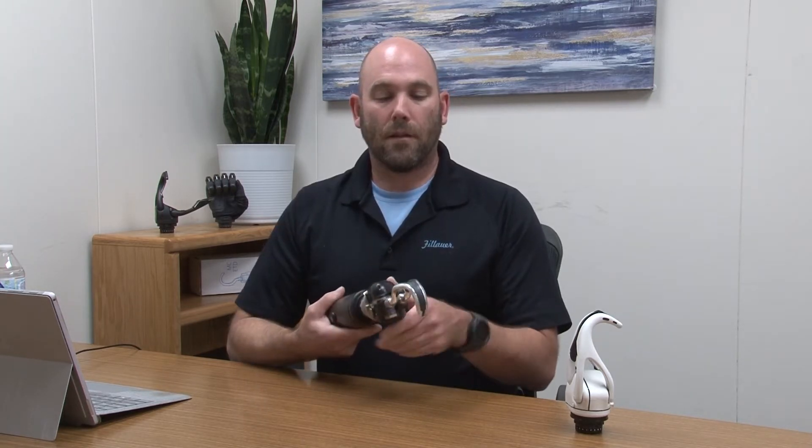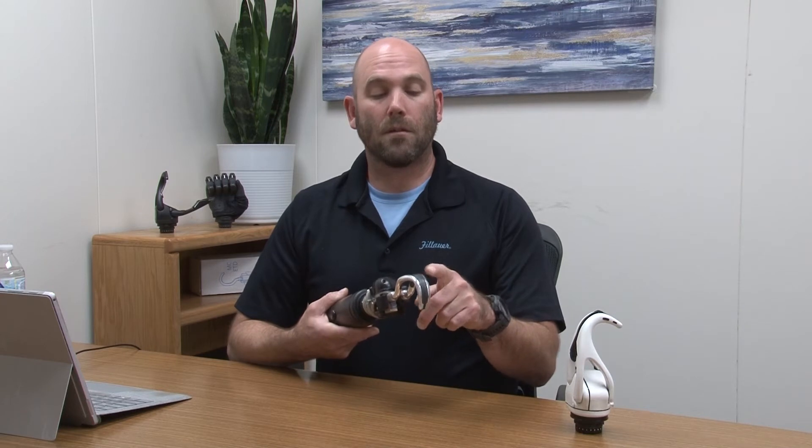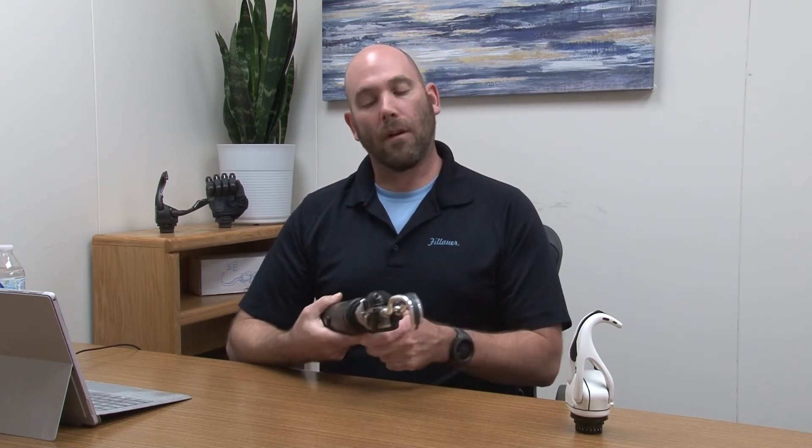With our ETD, titanium fingers are available. It doesn't make the device any lighter, but it does make it much stronger. If you are a heavy-duty user, the titanium fingers will give you that added security of knowing that you can get in there and really grip some of those heavier objects.